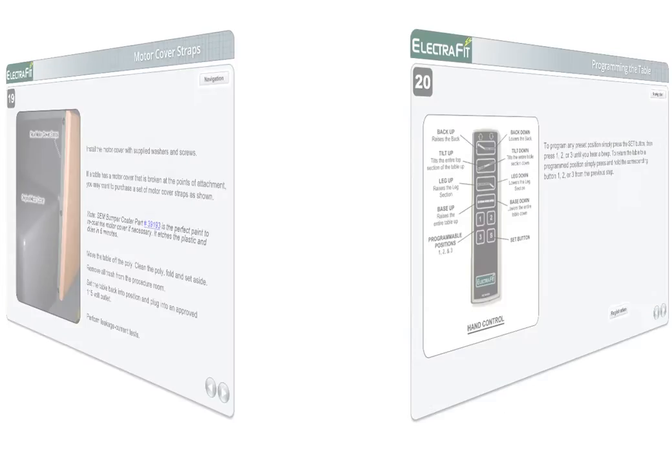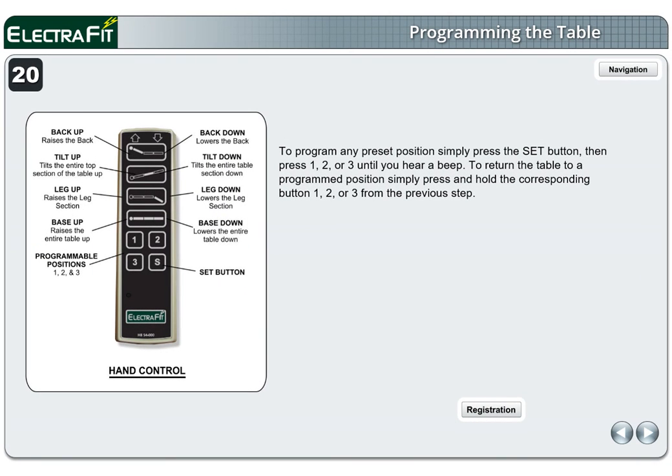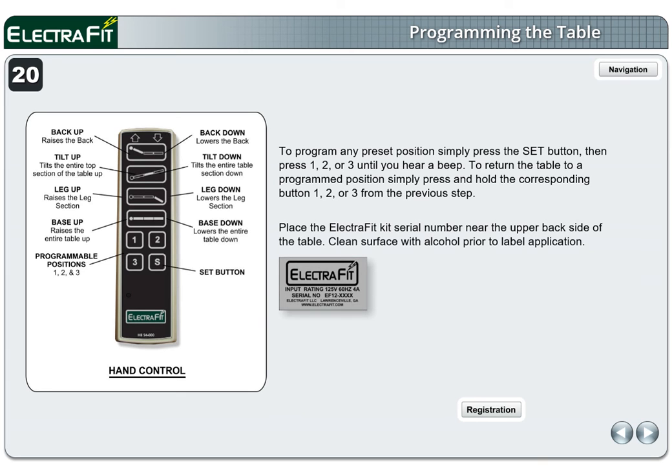Page 20. To program any preset position, simply press the set button, then press 1, 2, or 3 until you hear a beep. To return the table to a programmed position, simply press and hold the corresponding button 1, 2, or 3 from the previous step. Place the Electrofit Kit serial number label near the upper back side of the table. Clean the surface with alcohol prior to label application. Congratulations — the table is now complete.